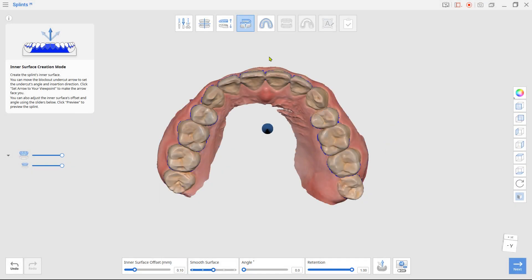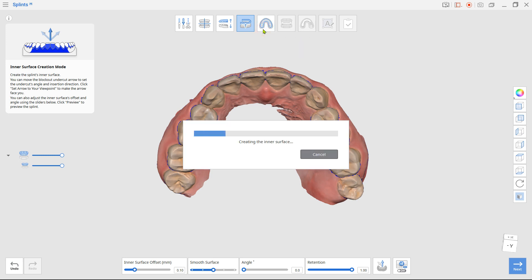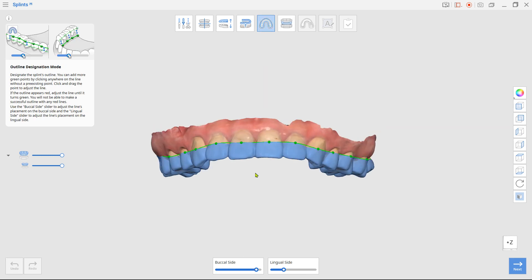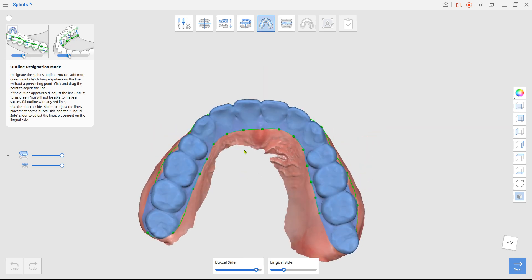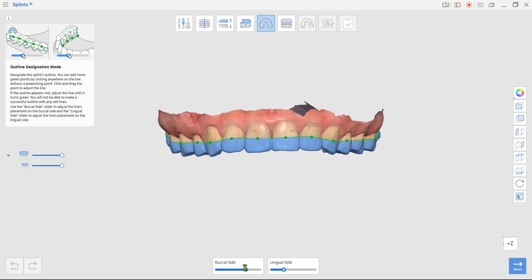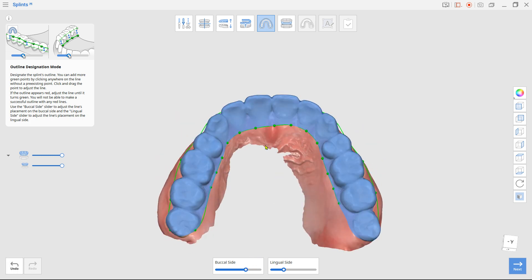Next is the outline designation mode. The program will automatically generate the outline of the splint. If the outline needs adjustments, use the sliders at the bottom or you can manually move each dot individually to correct it.